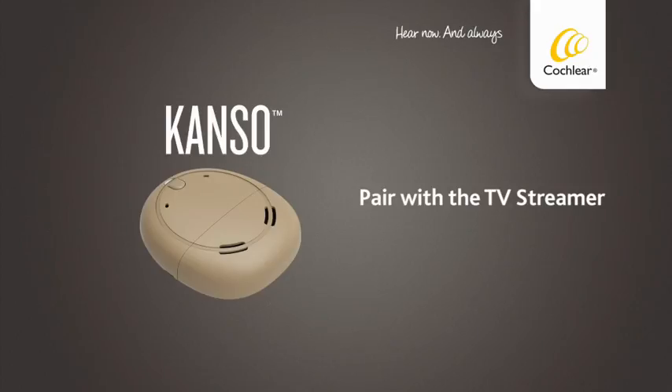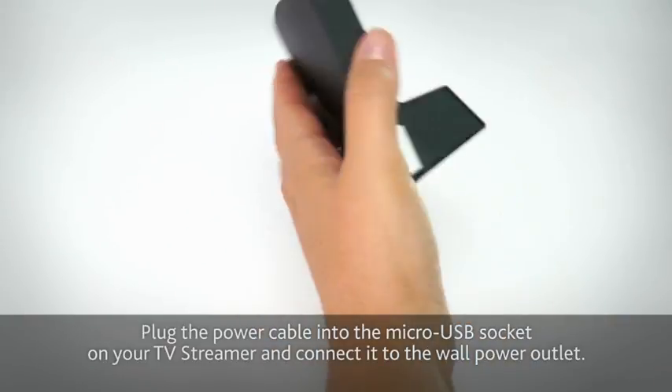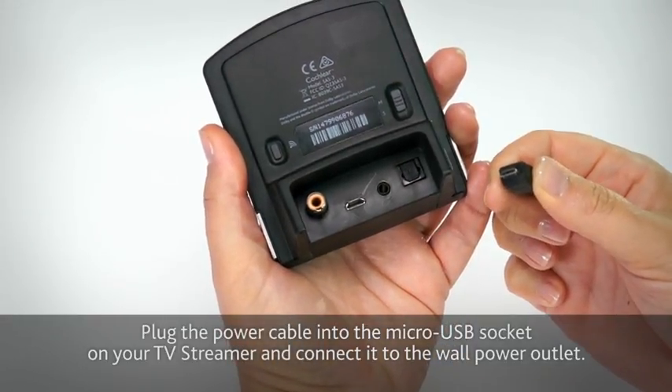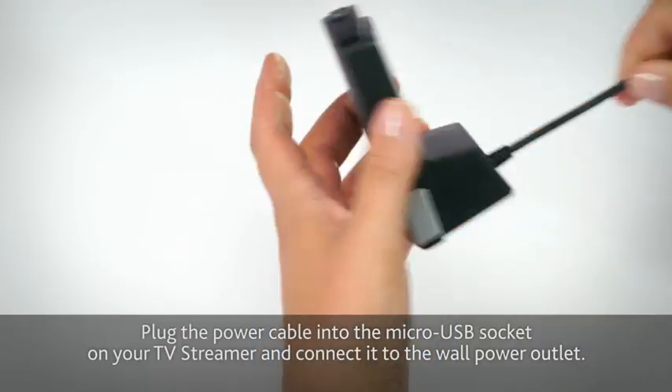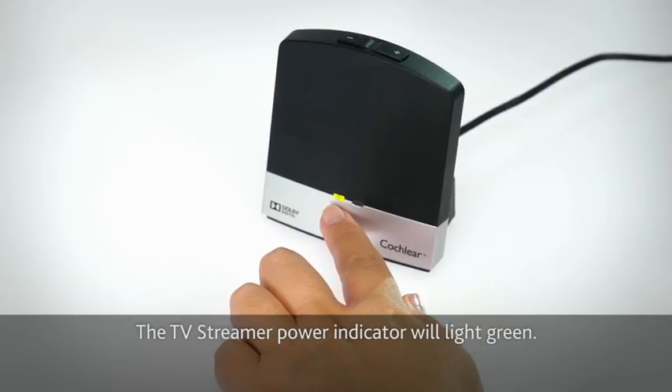Pair with the TV streamer. You first need to pair your TV streamer with your sound processor so they can communicate. Plug the power cable into the micro USB socket on your TV streamer and connect it to the wall power outlet. The TV streamer power indicator will light green.